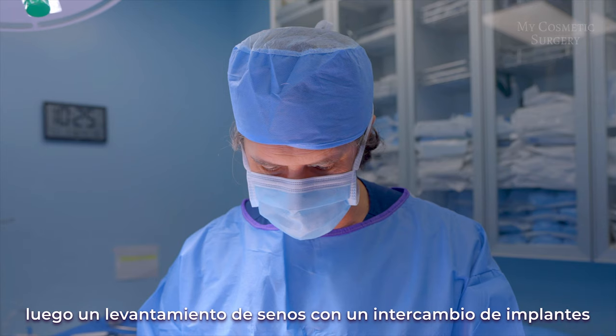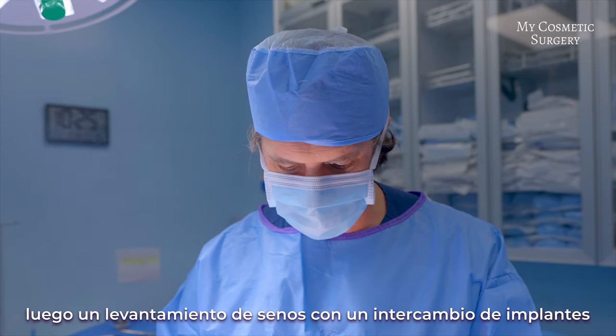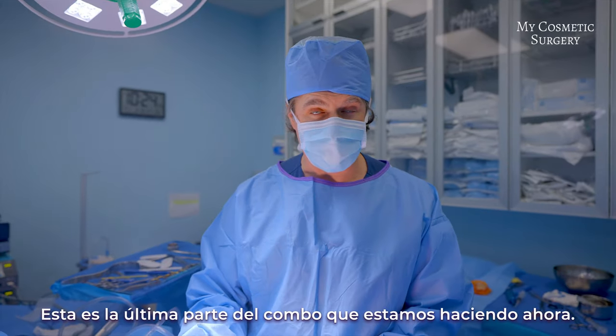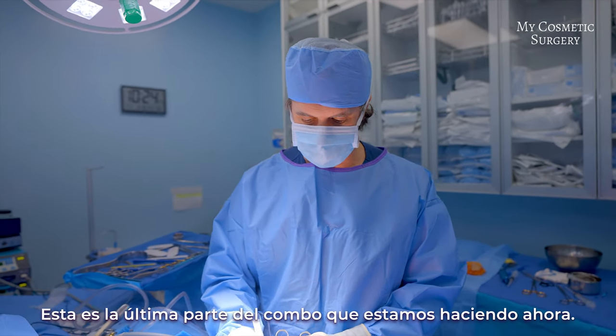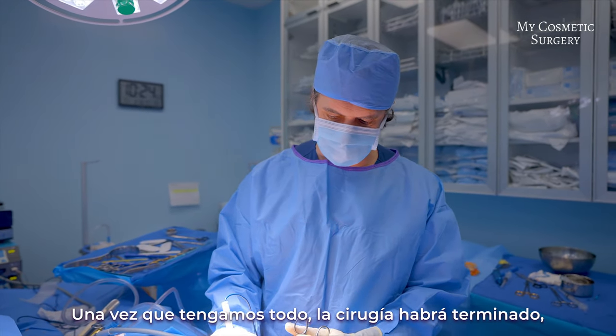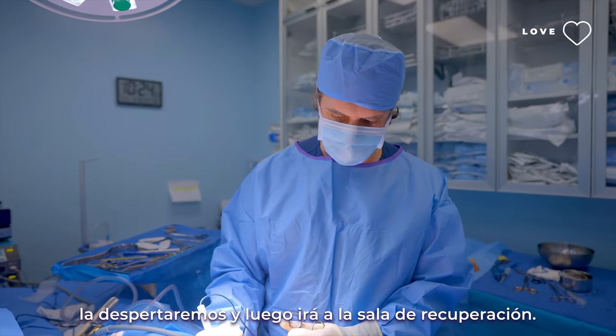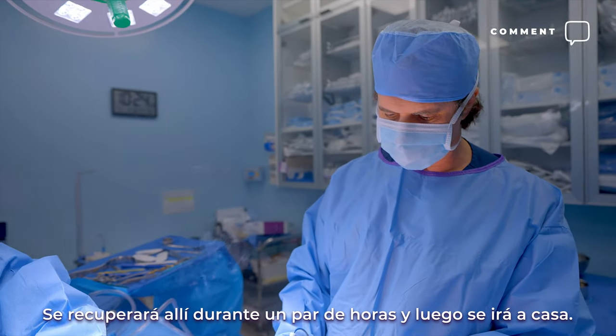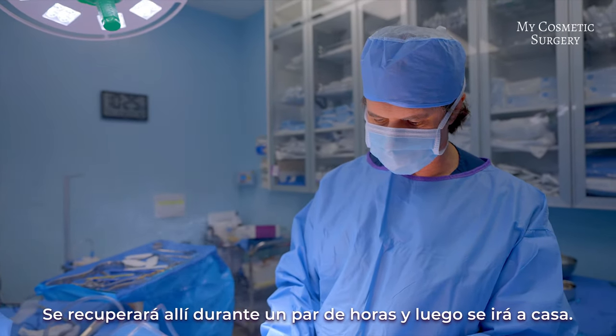So we did liposuction with a fat transfer and then a breast lift with a breast implant exchange using a silicone implant. This is the last part of the combo we're doing now — the breast lift, which is the mastopexy, with the implant exchange. Once we put everything together the surgery will be finished, we'll wake her up, she'll go into the recovery room for a couple of hours, and then she'll go home.